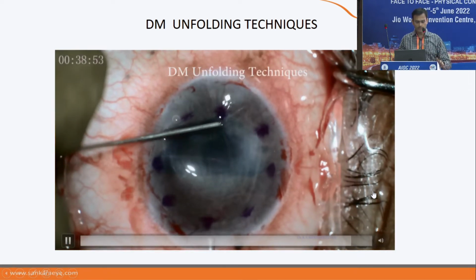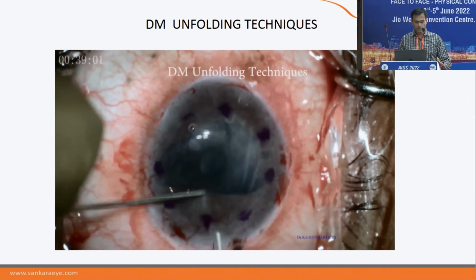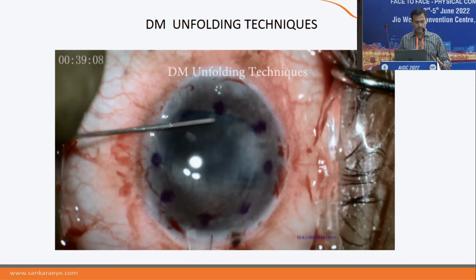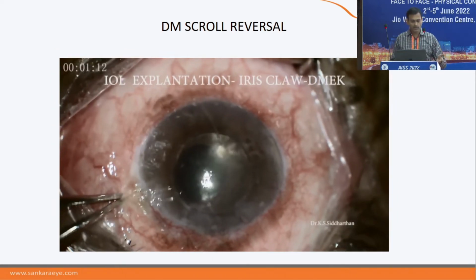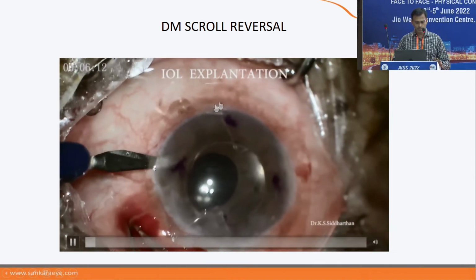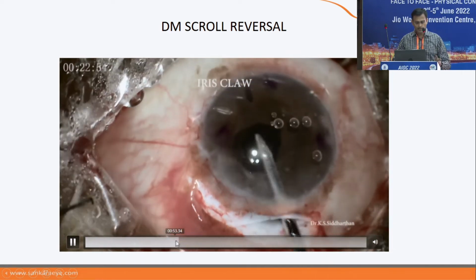So this is, again, I'll just show you a very easy one. You hold with the left hand, inject saline, hold it, push it to whichever position you want, hold with the left hand, inject saline, and it opens. So this is a technique which we use. And here I want to show you, suppose the orientation is wrong, it goes in the opposite side. This is an old anterior chamber IOL.